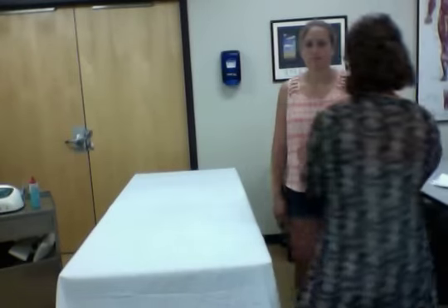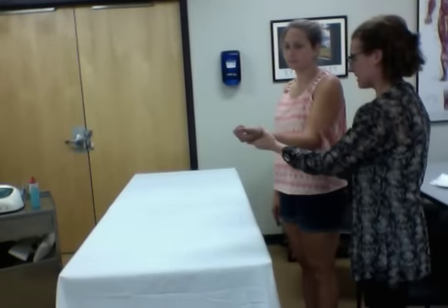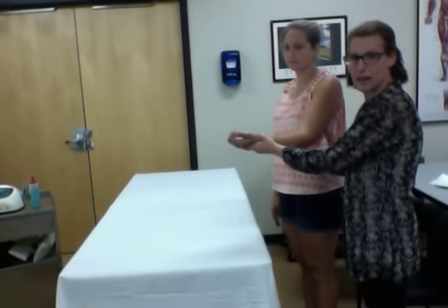All right, our patient today, you can't tell, is a 28-year-old, 5'10", 195-pound male who had a radius fracture 8 weeks ago. He was immobilized at the wrist and elbow, meaning the wrist at neutral and elbow at 90 degrees for 6 weeks. Currently, he's having difficulty fully extending his elbow. So his full elbow extension stops about here.